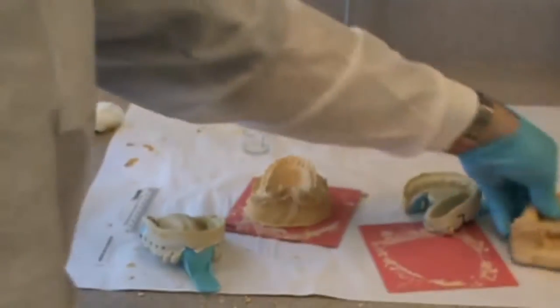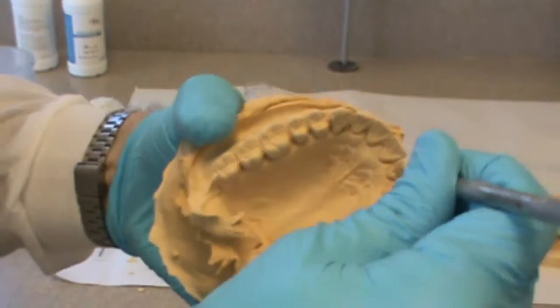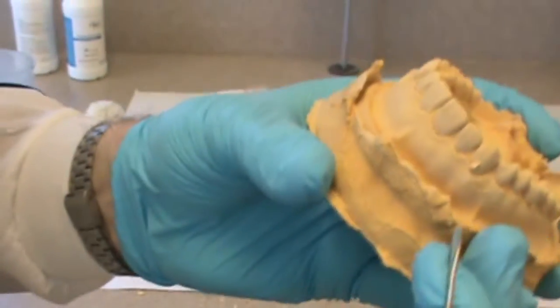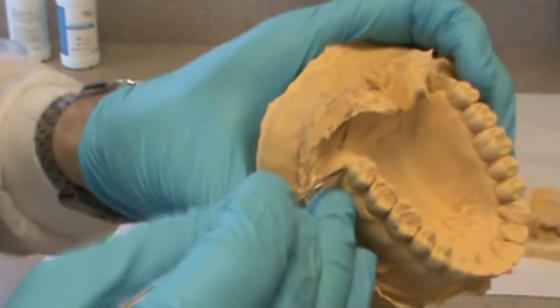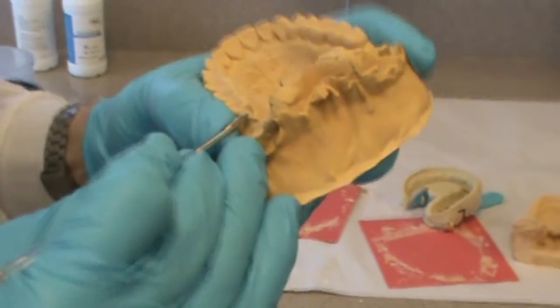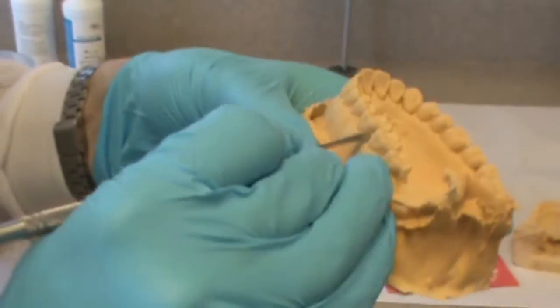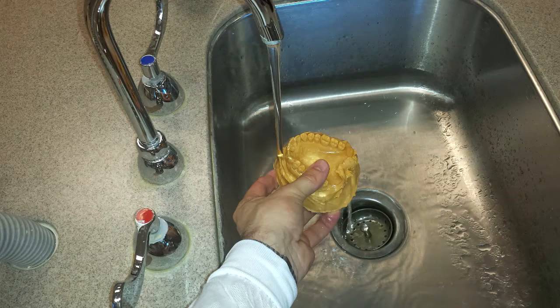When you pour up your cast, if you have positive nodules — meaning nodules that stick up off the cast — those are voids in your impression. If you have negative voids in the cast, those are air bubbles that were present when you poured up the cast. So you can tell where the bigger mistake was made. If you've got a lot of positive nodules, that's a problem with your impression. If you've got a lot of negative voids in your cast, that's a problem with pouring up the impression. And if you have both, then you may need to make adjustments on both.